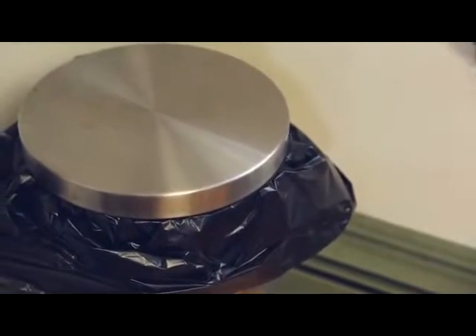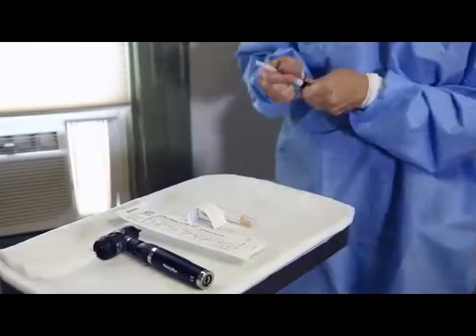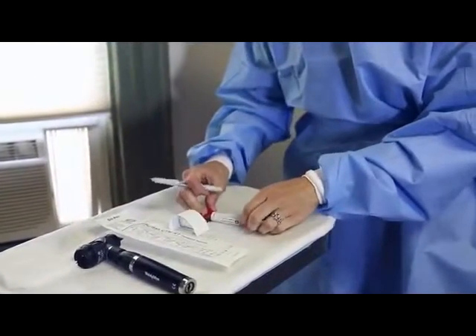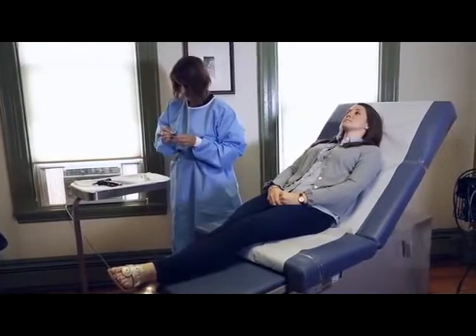Remove and dispose of gloves and mask properly. Label vial with appropriate patient information. Deliver samples to laboratory for testing.